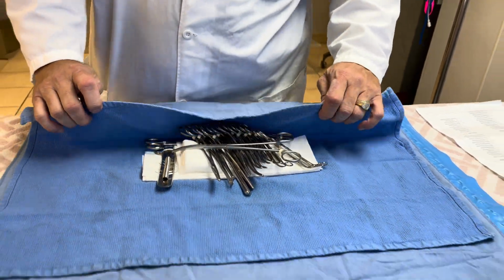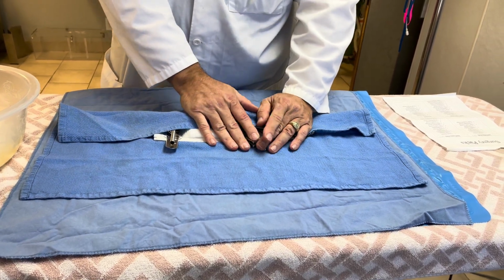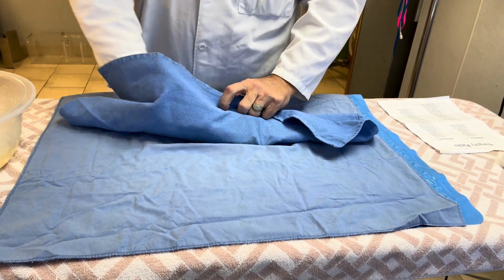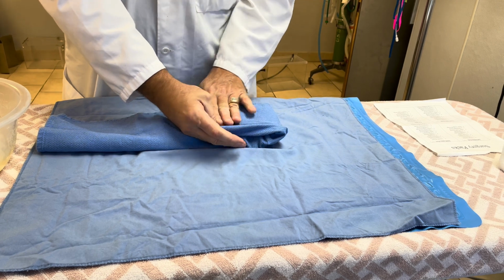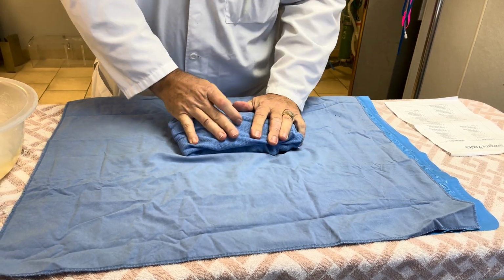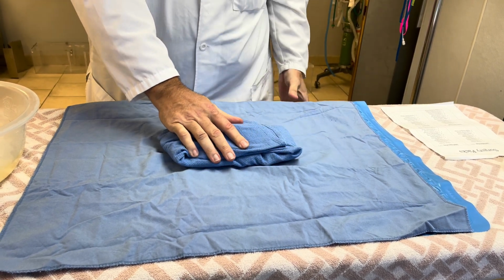And now, you're gonna pull this over, and you see, with the spay hook in, you can push these over to the side a little bit, okay? And then you're gonna pull this over. So you see how we're gonna make this a trifold, okay? And then you pull this and that. It's important that these things be tight, okay, when we wrap them.